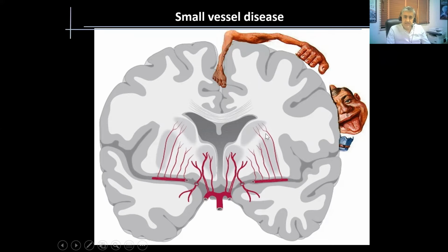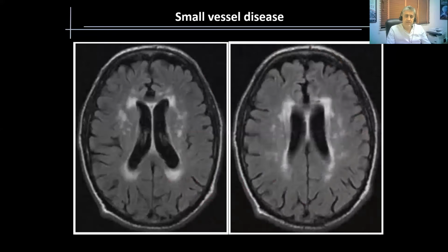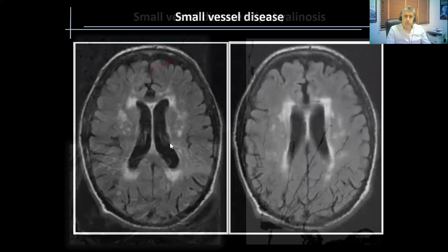And it is a disease of these small, narrow arterioles which causes the images that we saw in the previous slide. And this is how it looks like, as we described: white lesions in the white matter of the brain, in the deep structures of the brain, which may be confluent, like you see here, for example, or they may be something like that, which in some other example we would call a lacunar stroke.